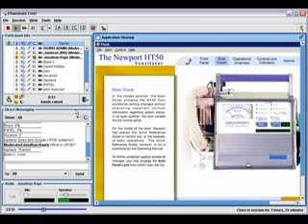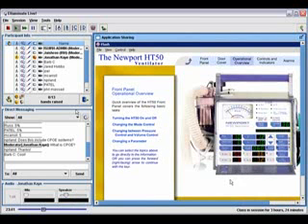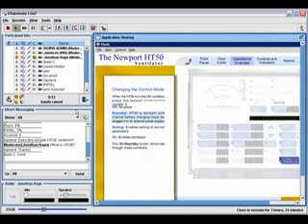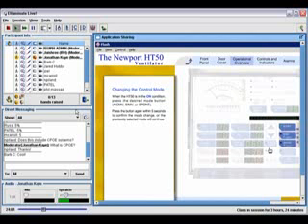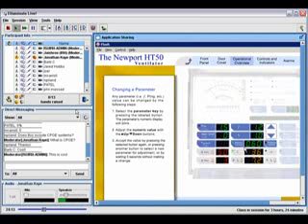practice operating, starting out with simple tasks like opening and closing this security door, go into more complex types of manipulation, turning the machine on and off, and then where they're actually practicing on what is for all intents and purposes the real device. You can see here some of it is grayed out, and so when you start with the simple tasks, we don't distract them by letting them change different options. But as they get to more complex tasks, then we open up areas and let them do what they would like to do and potentially make mistakes.